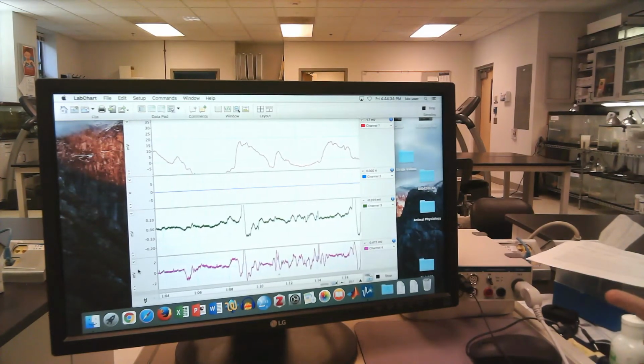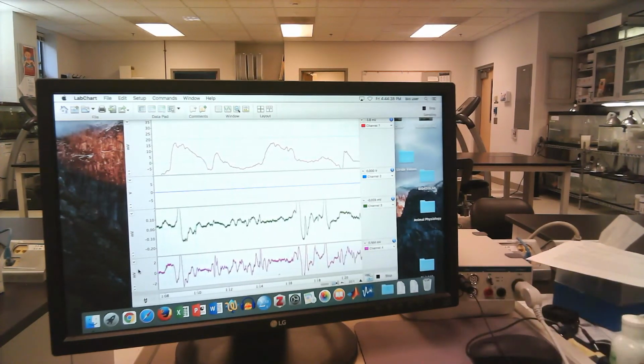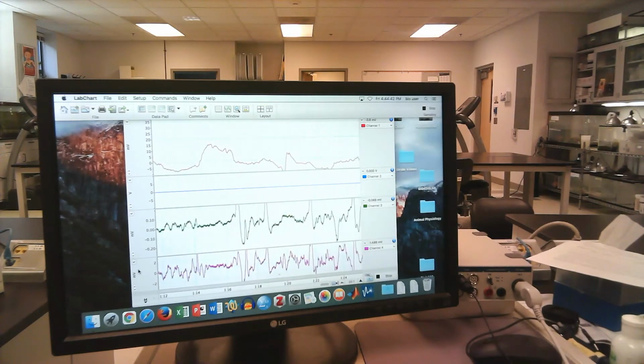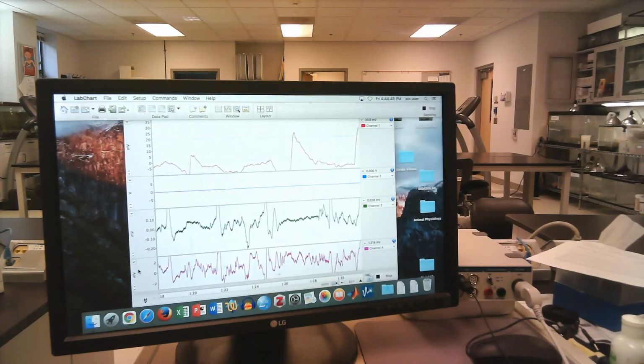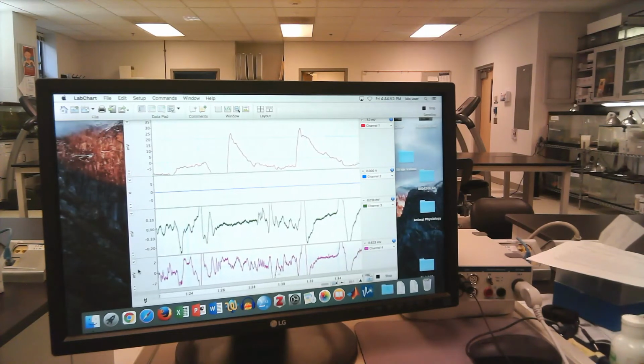And you may have to play around a little bit with putting the electrodes on your ankles, switching wrists to figure out a configuration that gives you a good signal. And it might also mean that you need a little more electrode cream just to get a really good connection with your skin. Our skin's not that great at conducting electricity.